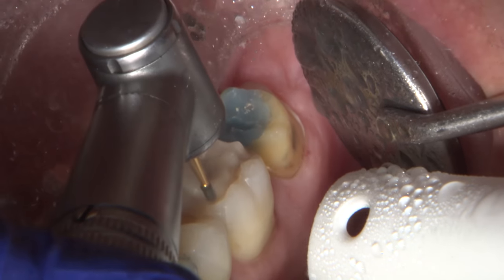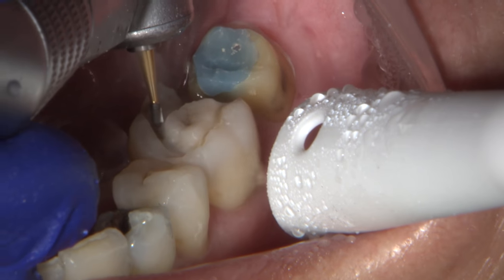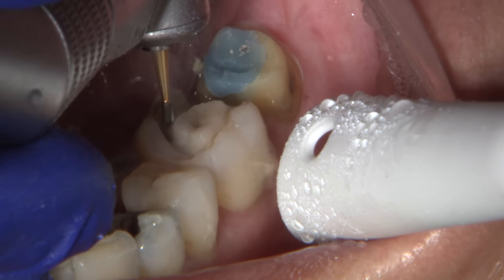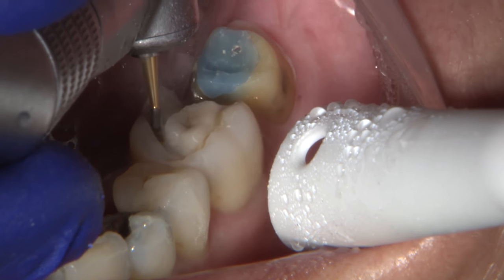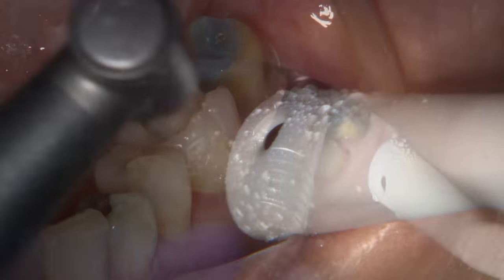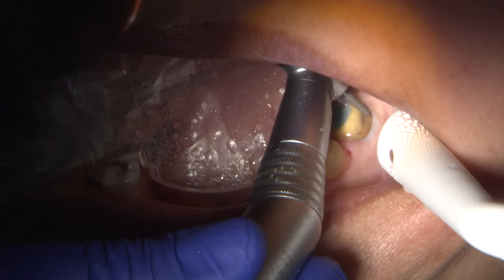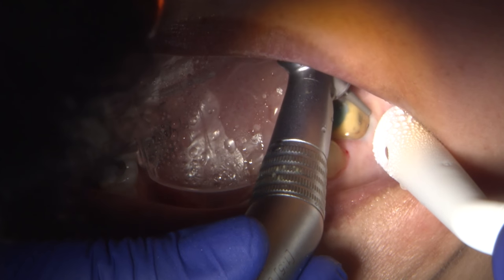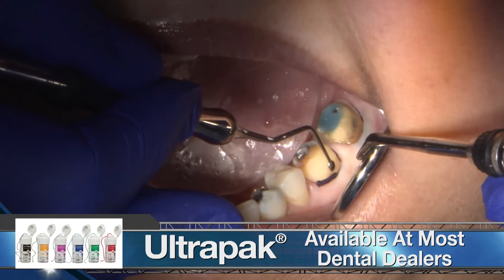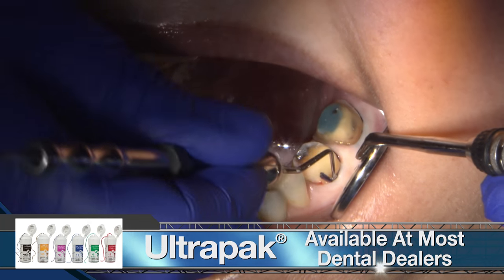To prevent this from happening again, we could have used Bruxzir, but I planned for the restorations on 18 and 19 to be obsidian pressed to metal and put this bilayer revolutionary material to the test. After removing the composite and preparing both teeth for obsidian pressed to metal crowns, I used the two cord impression technique. I utilized 00 size for the first cord and size 1 for the second cord.